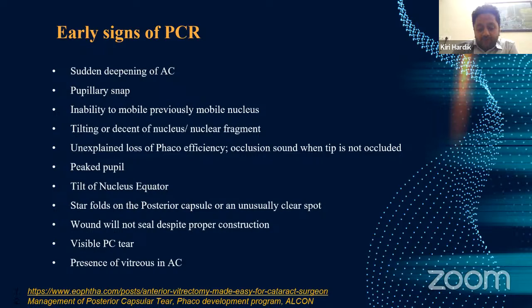Always have good observation and develop good surgical skills, so you will be able to identify these things earlier. Whenever a complication happens, you can identify it and avoid potential further complications. You can manage the case immediately.